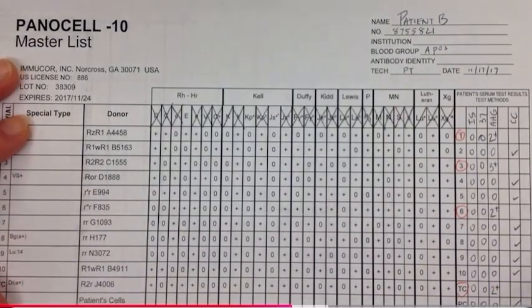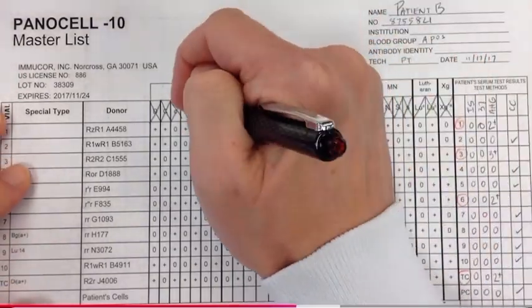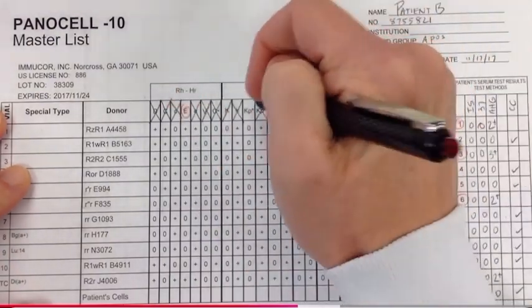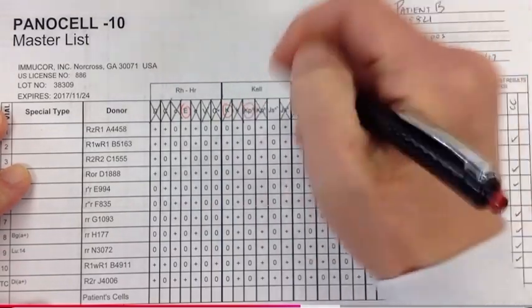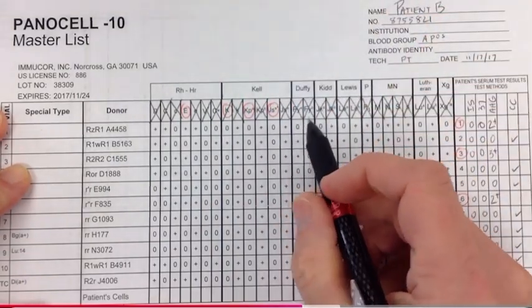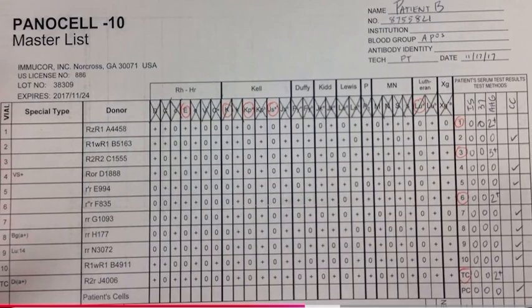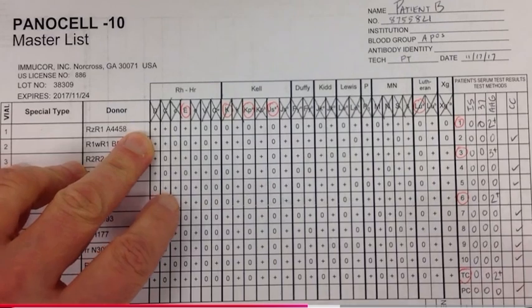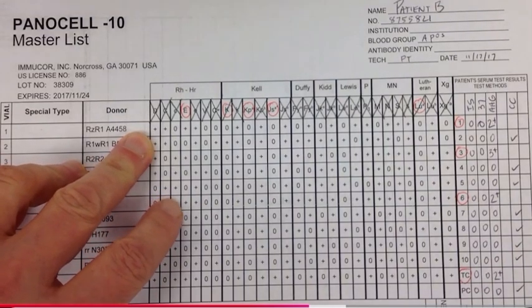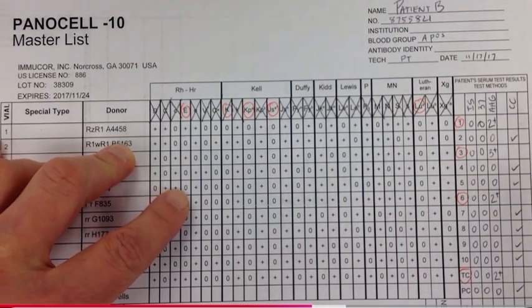Okay, all right, we've gone through everything. All right, now what I like to do is I like to go and take a red pen and circle the things that we have left. Okay, so we have big E, we've got Kel, we've got KPA, we've got JSA, and we've got Lutheran A. So these are the ones that are not double crossed out, that don't have an X through them. Either they were not ruled out at all or they were heterozygous. All right, let's go ahead and talk about these and see if we can get rid of some of these.